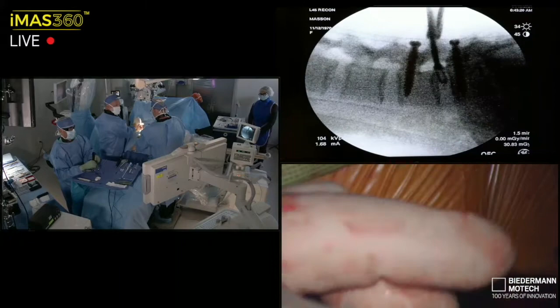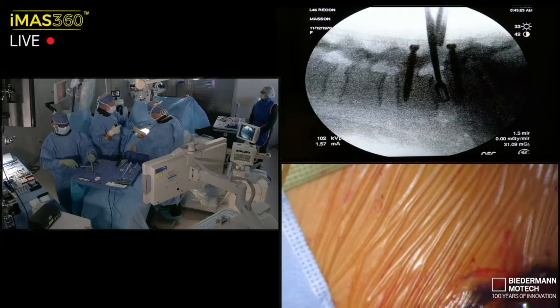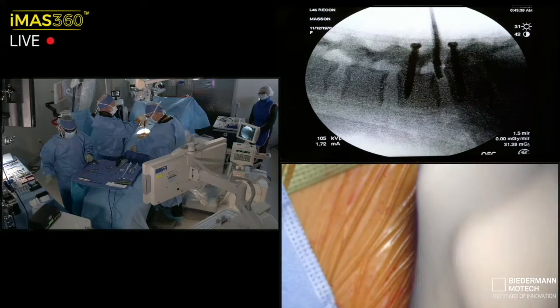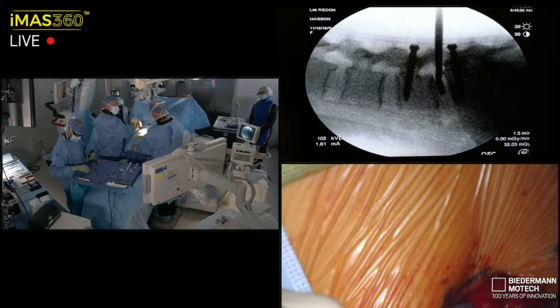And I don't like to take instruments in and out, in and out, in and out. I try to finish each step with each instrument. For this phase, I've already got a path of least resistance. I'm going to take the retractor out. I'm just going to let this find the hole. See how it found the divot on lateral fluoro? So I'm gently going to just turn that corner. Get cross midline.